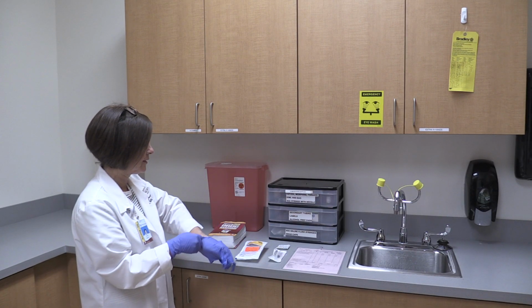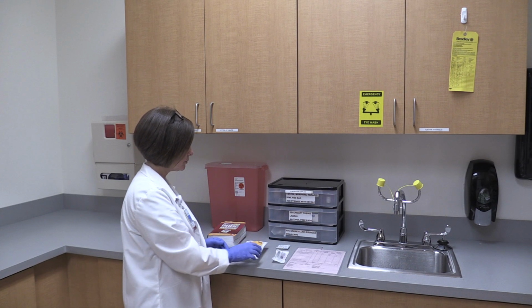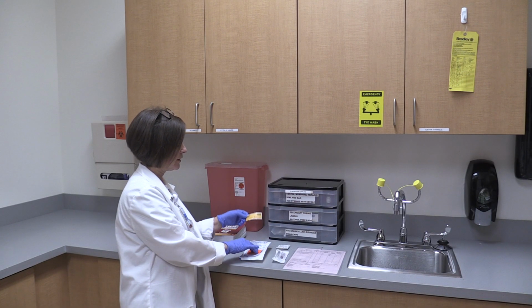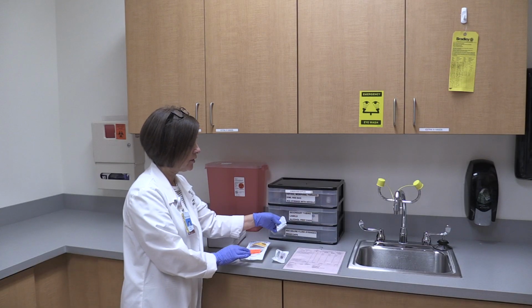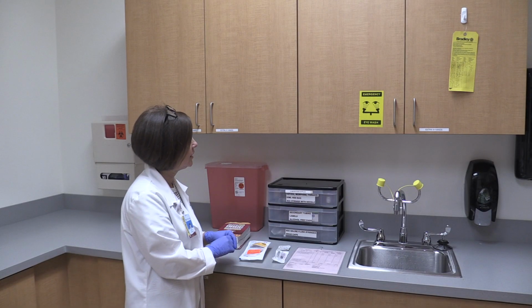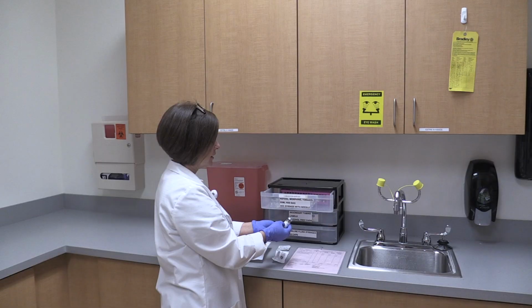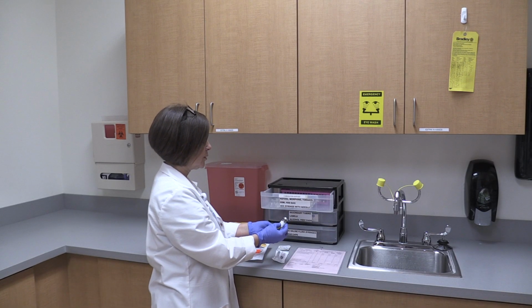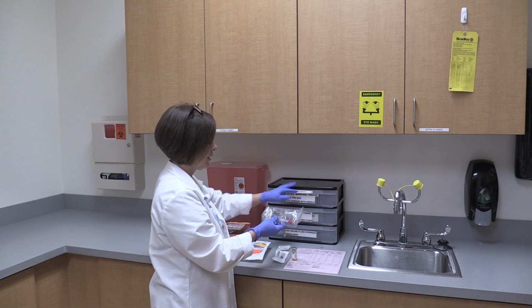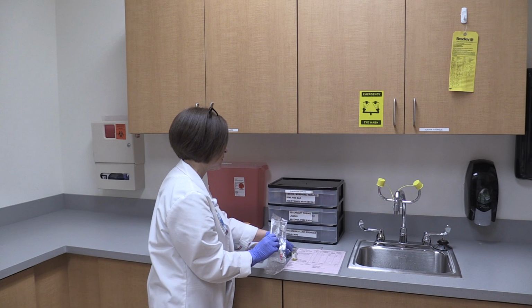And gather my supplies. So for this, I will need a syringe with a needle, secondary tubing, a label for my medication bag, a label for my tubing, alcohol swabs, and my drug book. I'm going to go ahead and pull my medication from the Omnicell. And it is cefazolin 250 milligrams per ml, which matches the MAR. And I am also going to need my 0.9 normal saline and verifying that against the MAR is correct.